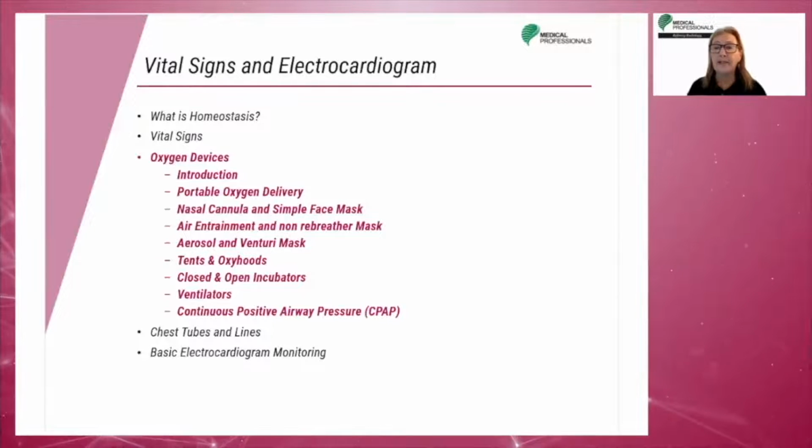The primary clinical indications for oxygen administration are to correct hypoxemia, which is a decrease in oxygen concentration in the blood, and possible tissue hypoxia, which is an inadequate amount of oxygen at the cellular or tissue level. In this section, we will show all the existing oxygen devices.